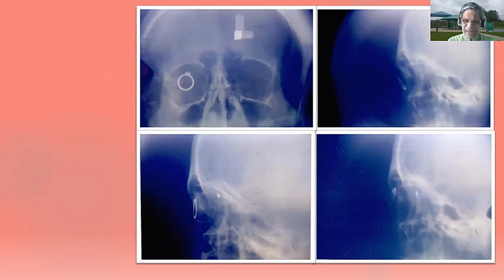Classify like this: physiological calcification, and pathological calcification. Physiological calcification normally occurs where? Your answer is, sir, above the sella you have the pineal body. The pineal body can be calcified in old persons. It can be a physiological calcification.